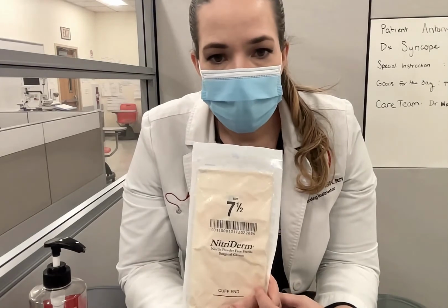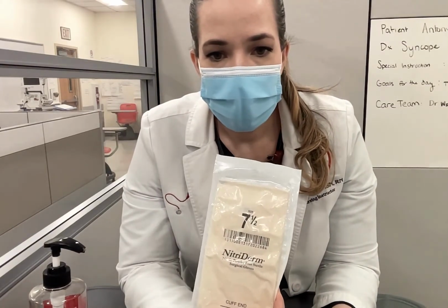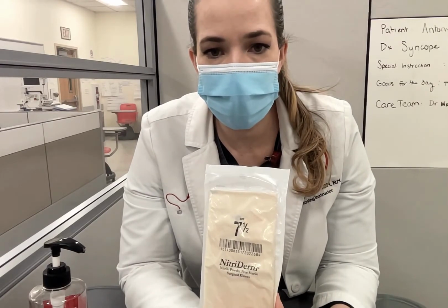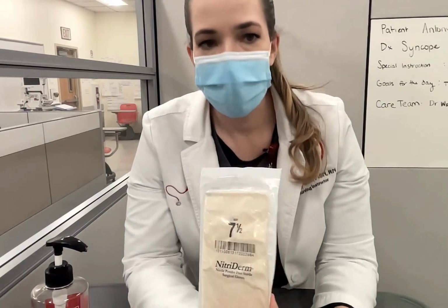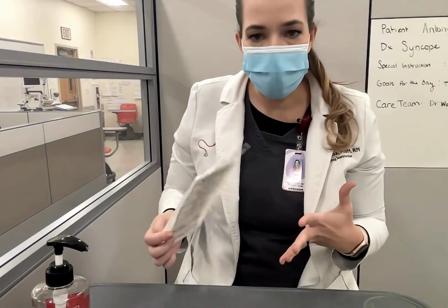So my size is 7.5. Hopefully you saw the struggle in the last video, because it is hard to put on a new pair of sterile gloves with this kind of thickness. So if you are pulling with all of your might, understand that's normal. We still don't break sterile.